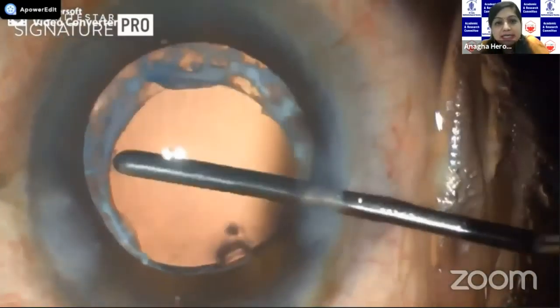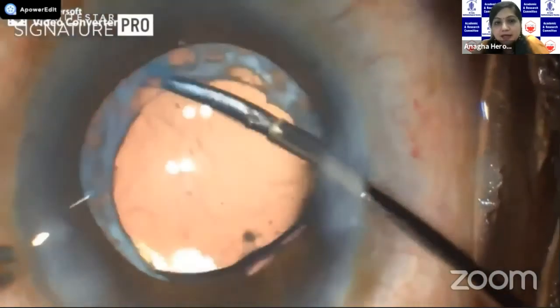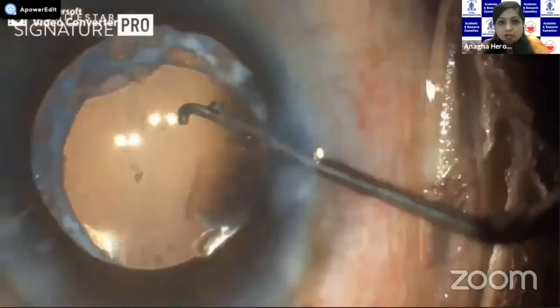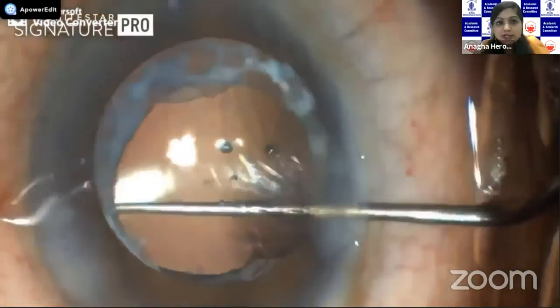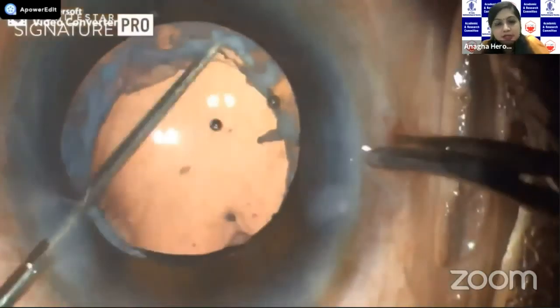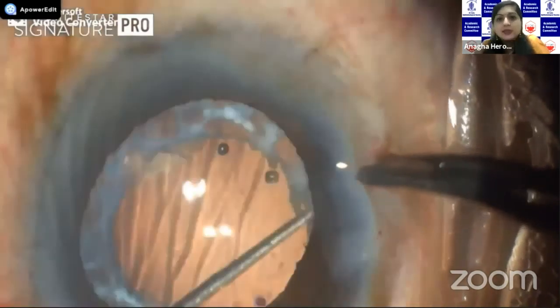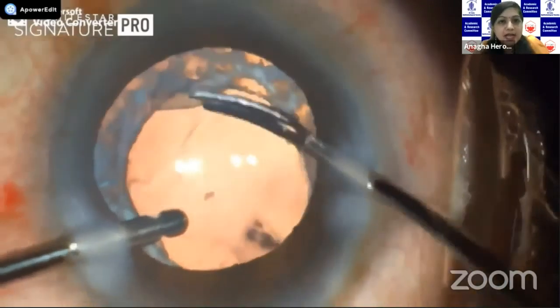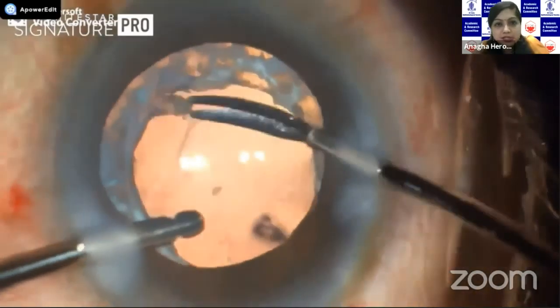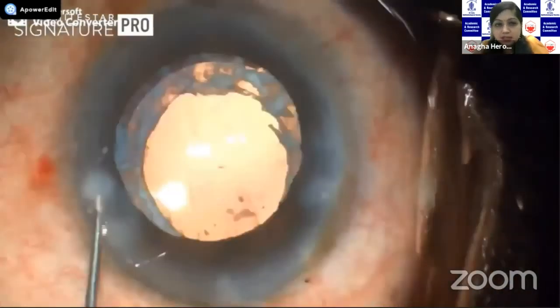It is important to complete this cortical aspiration; otherwise there could be a cause of recurrent inflammation in the postoperative period. Once the cortical cleanup is done, I could still see the subcapsular plaque in the periphery, so I'm trying to do a blunt dissection. However, it was very, very adherent. In one area around the six o'clock it was a little loose. We tried with the Sinski hook to complete dissection of the peripheral subcapsular plaque, but it was not easily possible. Since it would not really impact the patient's vision, we left it at that — only the six o'clock part, which was really loose, we cut off. We were able to center the lens well and complete the surgery.